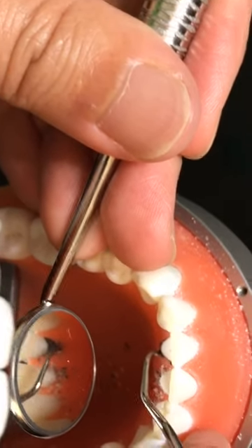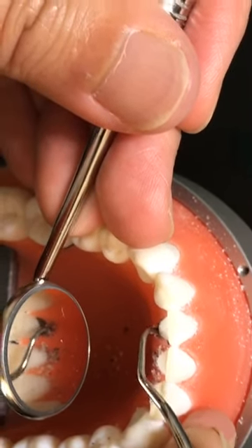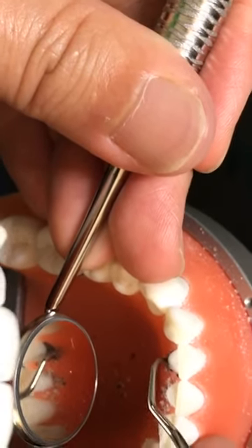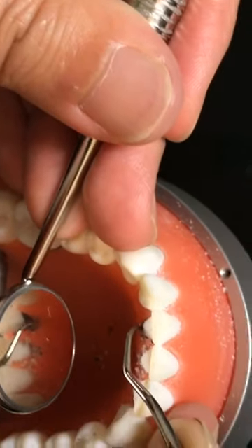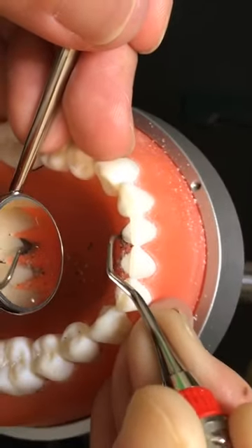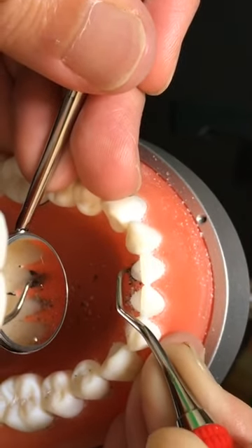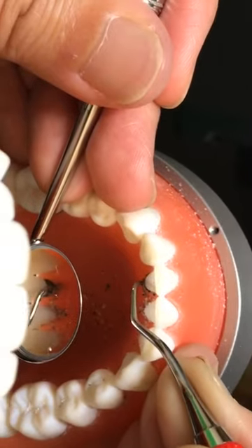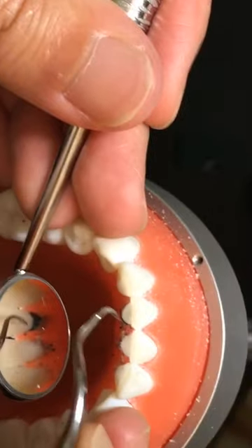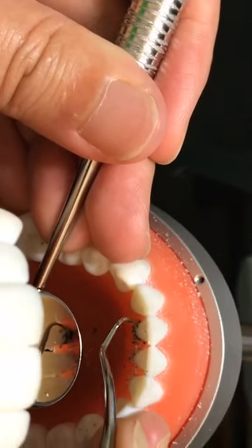Feel the calculus, then move two millimeters — very, very baby strokes. Continue to adapt the toe one-third. I usually take away the lingual calculus first — that's where you get the most. Adjust the angle to the surfaces towards.